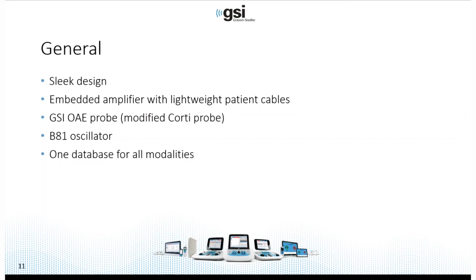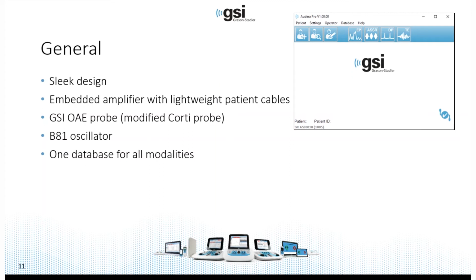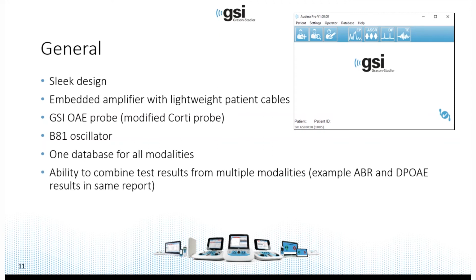In addition, there's one database for all modalities. So for those of you that have used the original Audera, it also had one database. But the difference here is you can actually combine test results from the different modalities in one report. So I'll show you that a little bit later. And that's so you can have ABR results as well as DPOAE results in one report, not two separate reports. The other thing that's nice is you can create a number of predefined report comments similar to GSI Suite, and that can save a lot of time when you're writing reports.